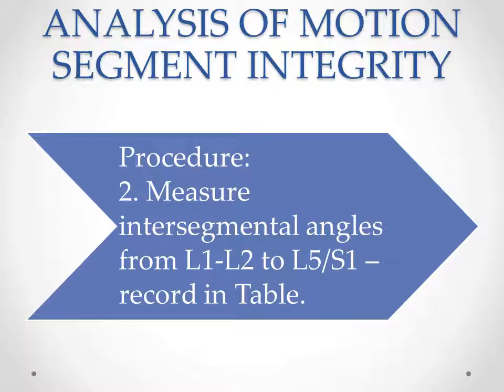So it allows you to get a starting point of each of the intersegmental angles. And I'll elaborate on that a little bit more.